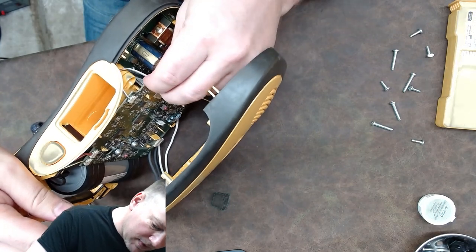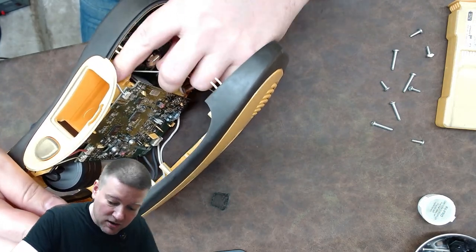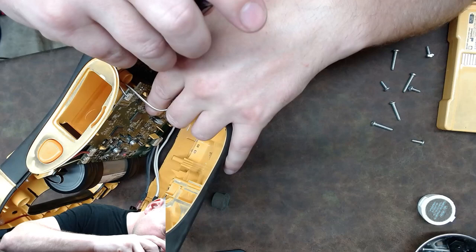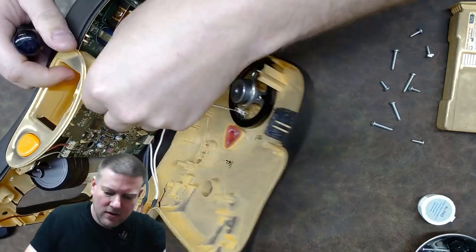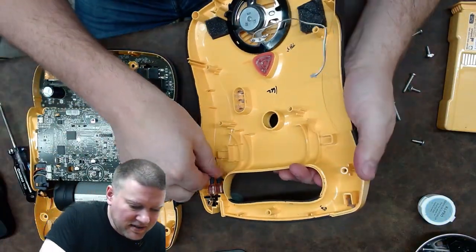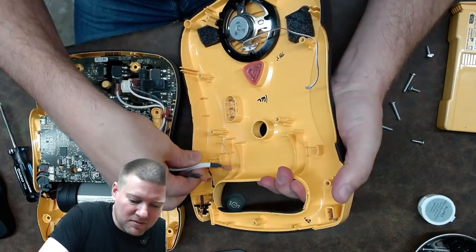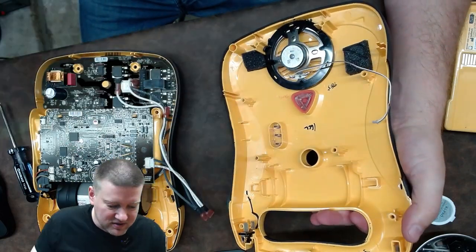We've got to be really careful because the capacitors on this unit could and probably are charged to some degree. I'm just going to get this cable out. There it is — one little connector and the battery pack interface. If you ever take these apart, do not reverse the polarity of these two cables. The bottom one is white, the top one is black.